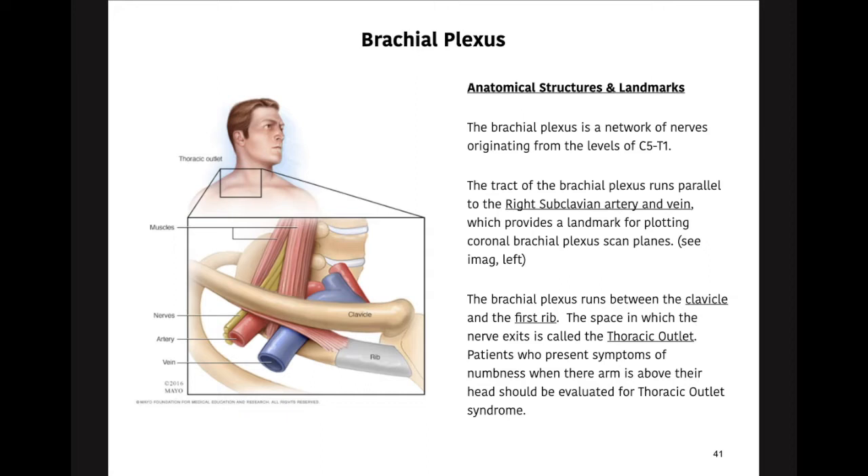The track of the brachial plexus runs parallel with the right subclavian artery and vein, so that's the landmark we use. Nerves are very, very small — almost like the size of angel hair pasta — and especially at the peripheries they get even smaller. When we're scanning an MRI of the brachial plexus, we're looking for a landmark to align it. Luckily for techs, that nerve travels parallel with the subclavian artery and vein, which is a pretty significantly large anatomical structure.